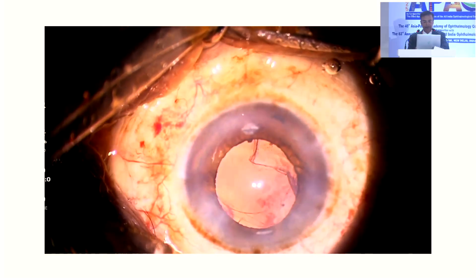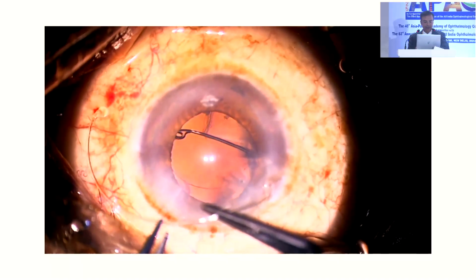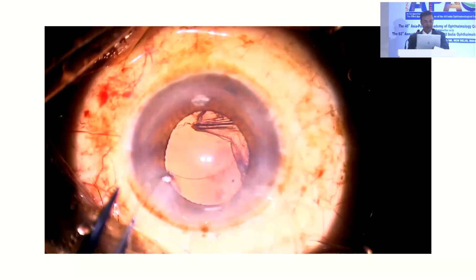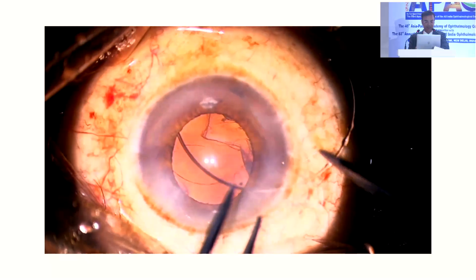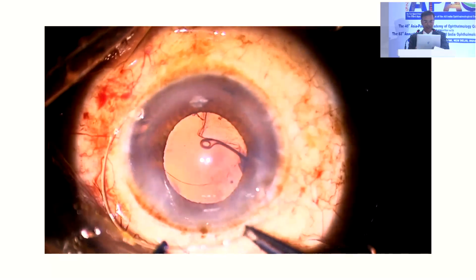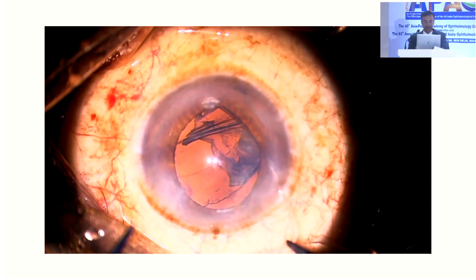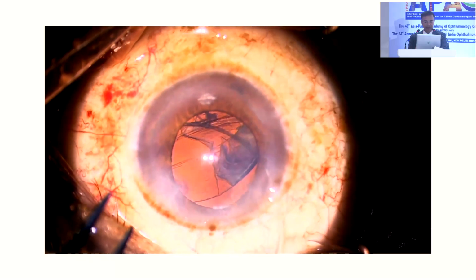And now that I have the bag in place, now comes what David was trying to show you. I'm trying to put in a CTR. I was seeing that video, and that was a lesson in what I decided is the wrong way. And David, as you said there, trying to go the other way now. And now again, I find that it's pushing it away, trying several ways to bell the cat. Now I'm pushing it in such a way that most of the CTR is in, but it's not helping. See, it's almost going to cause the whole thing to get broken. So there's no way it's going to go there.